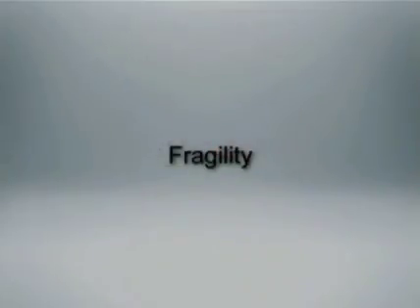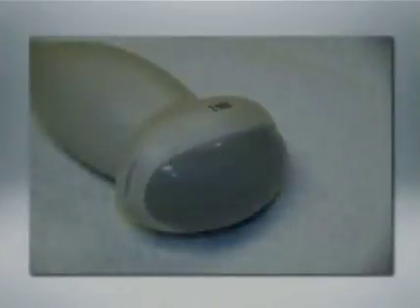These transducers, because they contain fluid and because they contain mechanical mechanisms, tend to be more fragile than other transducers. And over the years, we've dropped several of these. I won't say that I've ever dropped one, at least I won't admit to it, but they have been dropped in our lab, and the transducer housing will crack and the fluid leaks out, and it's very expensive to have these repaired.